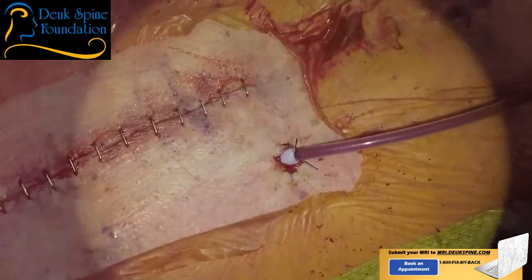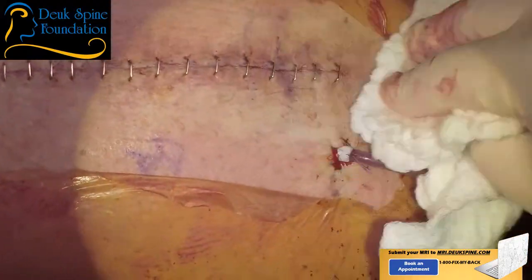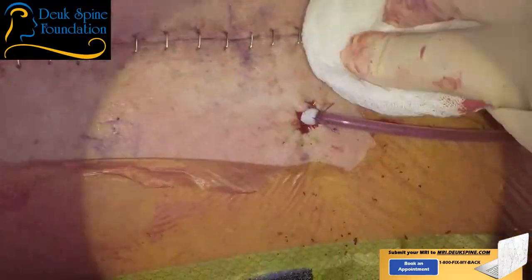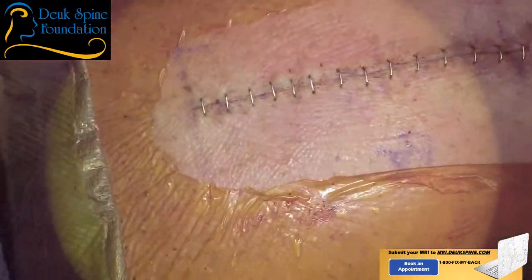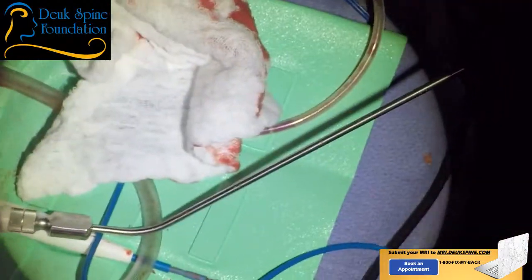Beautiful. Where's my wet dry? Right here. That's the wet? Yeah. Not very wet. All right, polysporin? Yes. All right, do you have any questions for me? Look how perfect that is. It's gorgeous. Polysporin. Right here, sir.